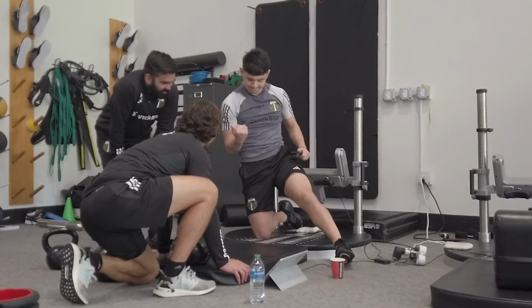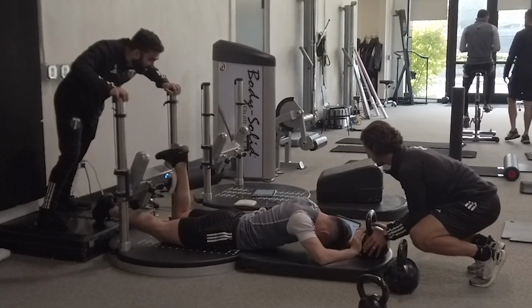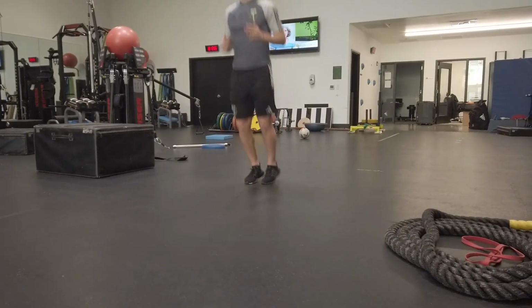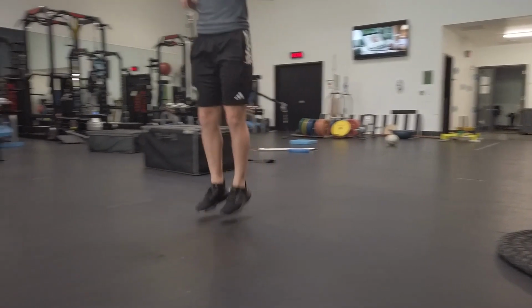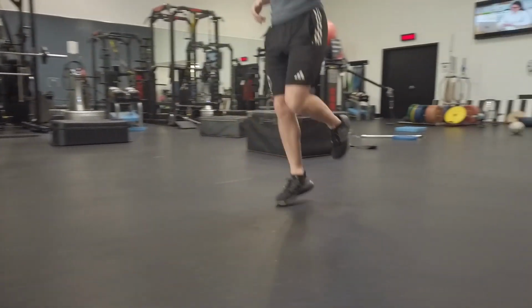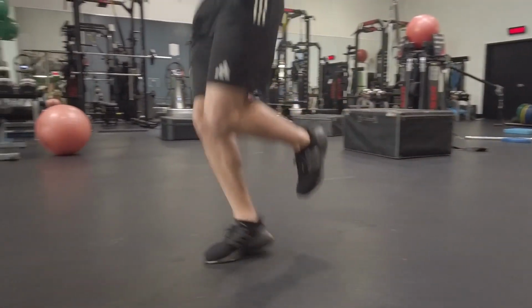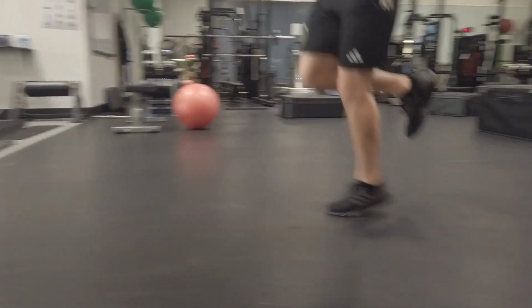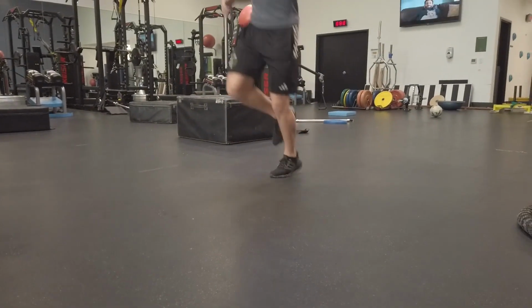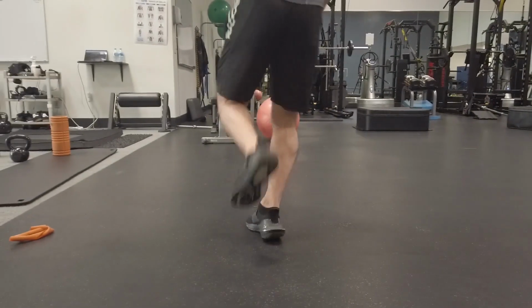We utilize the KangaTech for pre-training assessments of readiness, and this can be applied to an entire team, but it also applies to the return to play process, so that if we're seeing a player who isn't testing as well as we'd like, we can modify their return to play that day, or we can actually push them a little bit harder.